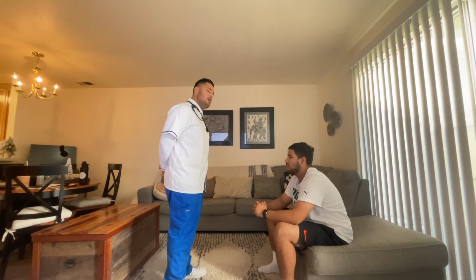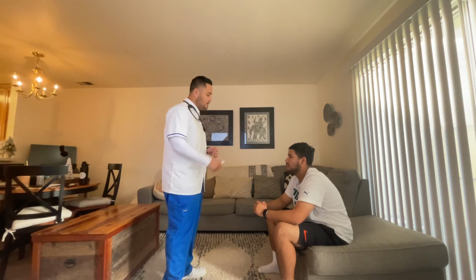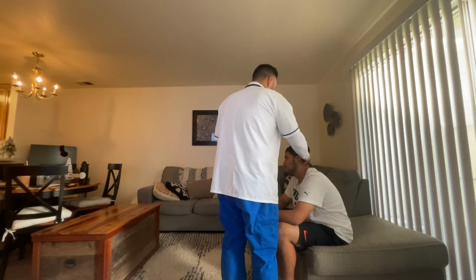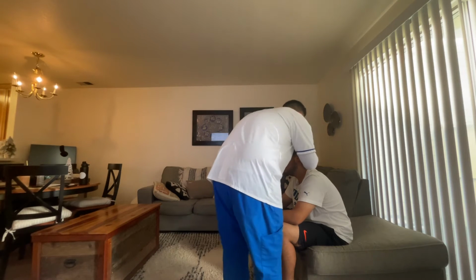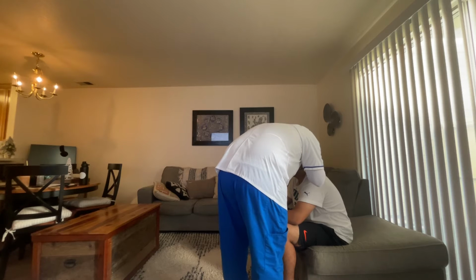Next, I'm going to be performing an otoscopic ear exam of the external ear canal and the tympanic membrane for my patient. Is that all right? So I'm going to pull the auricle up and back because he is an adult male. I'm going to grab my otoscope, which is my pen light at the moment. On inspection of the outer external ear canal, there is no drainage, redness, lesions, or any signs of foreign body.